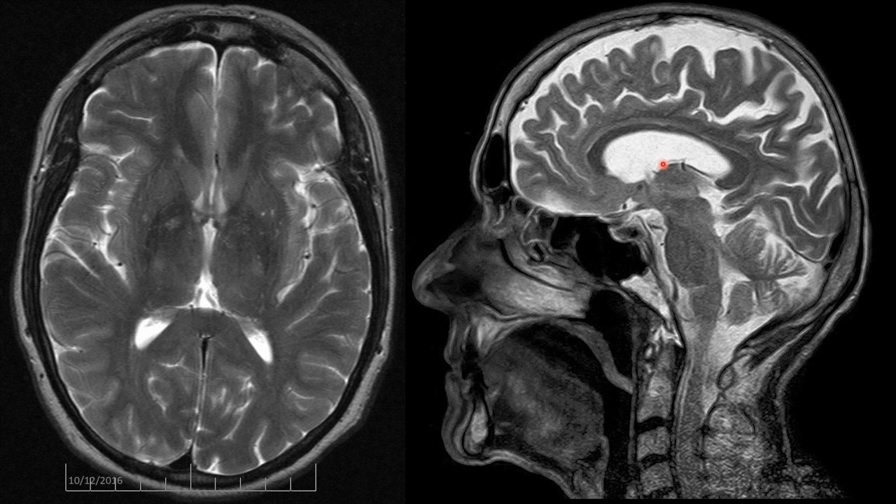T2 means that fluid, in this case the cerebrospinal fluid surrounding the brain, is bright white. These are your ventricles, which are normally filled with dark fluid on a CT scan, but they're showing up bright on this MR image. And we're going to move on. So we've got the brain, very classic images there.